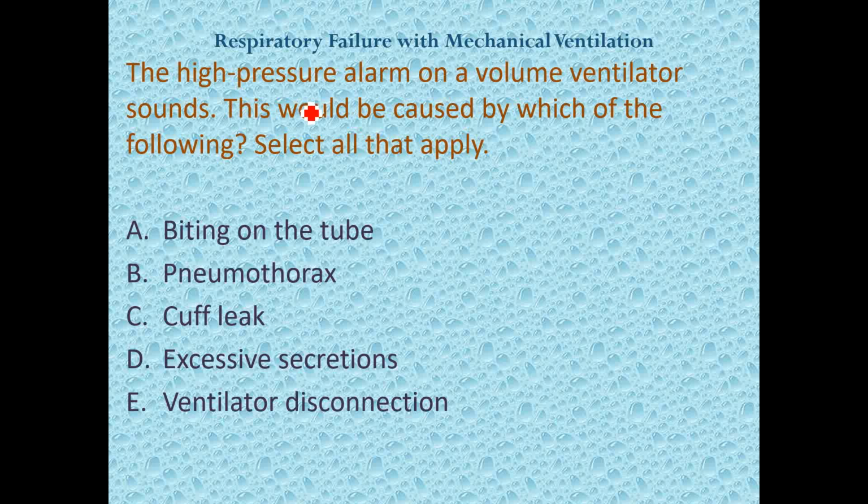What happens is when a patient is placed on a ventilator, the respiratory therapist will set, per the patient's physiologic normal, because every patient can be different, what the patient's resistance is inside the lungs. In other words, as the ventilator is blowing in air, just like you blow air into a party balloon, if the balloon has never been blown up before, you know that you're going to have to put more force behind blowing in air versus a balloon that's very stretchy. Then it's much, much easier to blow in air, and it's the same thing with the lungs.